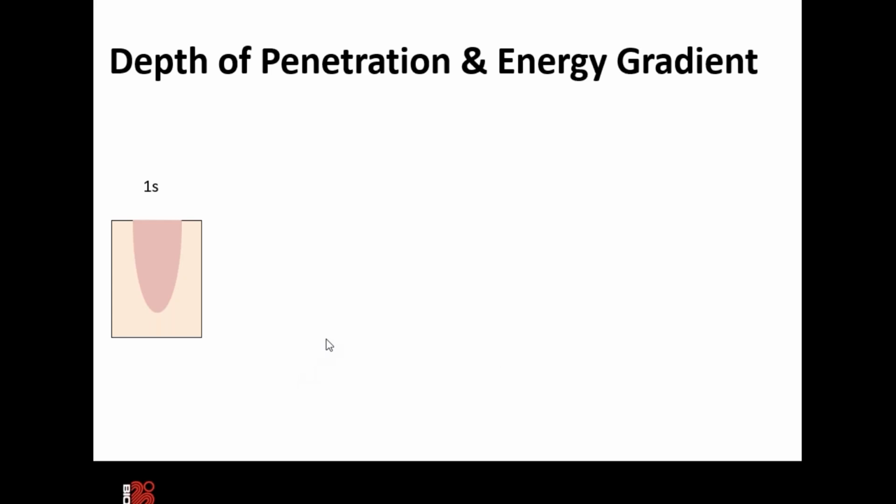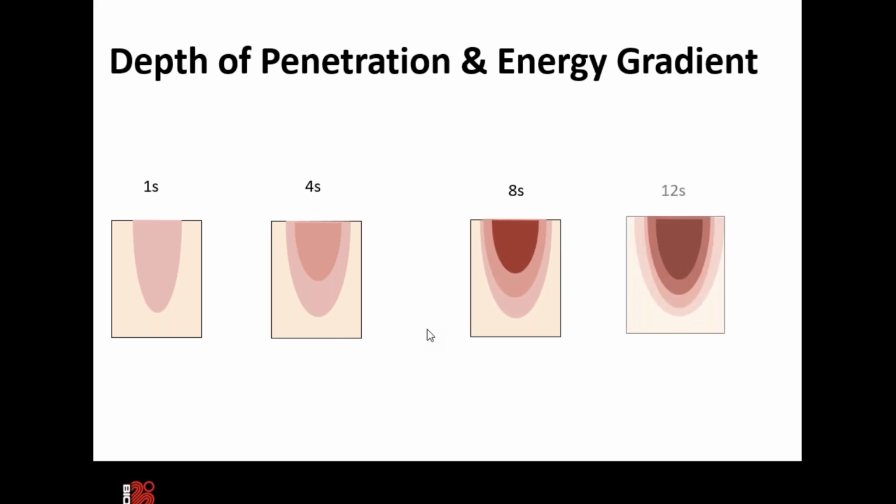The longer that you hold the light source on the tissues allows for light to actually accumulate and be more effective in the deeper areas of the body. So you'll see that when we treat, say, really large joints or deep areas like the hip, the device is on longer than if you're treating more superficial structures or areas of the body.